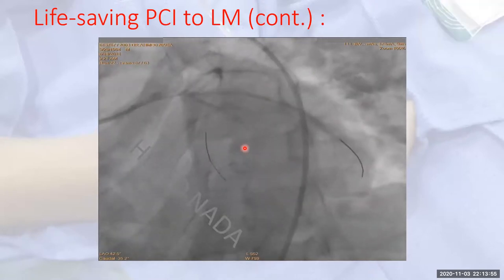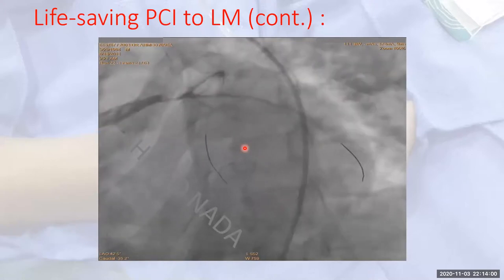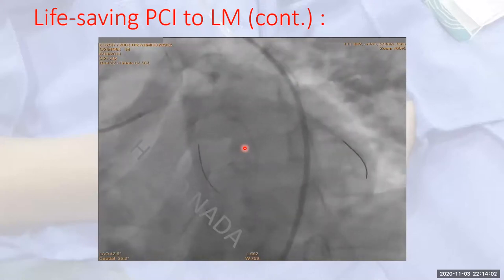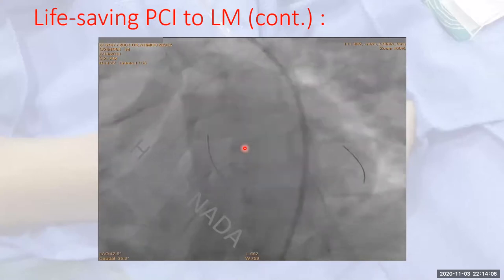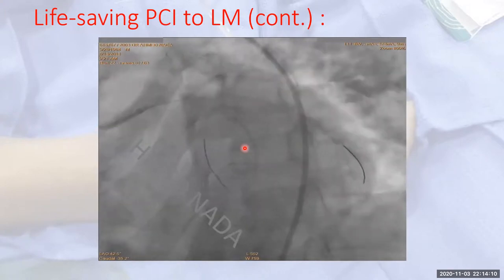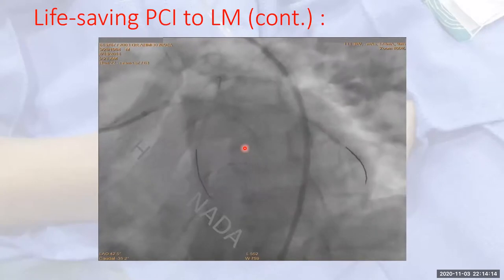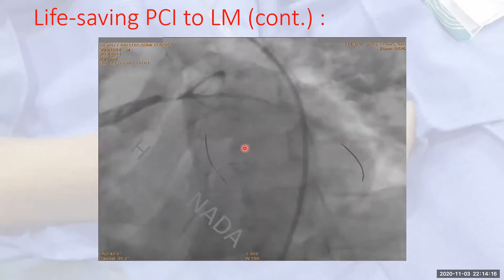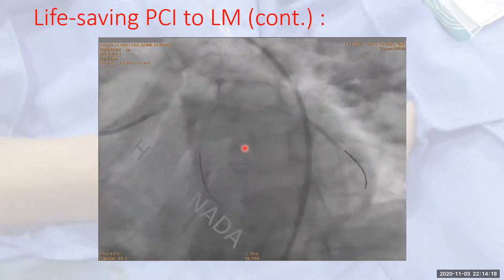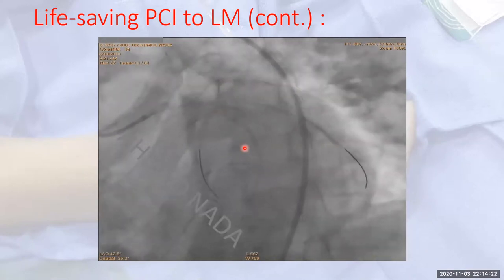Okay, perfect. So coming to the mentioned point, actually the patient was hypotensive. So we have a limited window to use any vasodilators, whatever the types. So it's not in our era. We try to use the 2B3A inhibitor injection. We inject all the loading inside. The problem that using thrombectomy, as mentioned by Dr. Hatem, that during manipulation, we realize that there is a tight lesion.